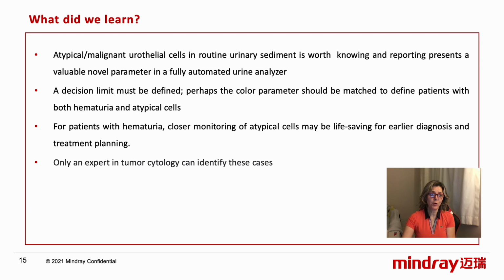What did we learn? This case has shown us that atypical malignant urothelial cells in routine urinary sediment are worth knowing and reporting, the presence being an available novel parameter in a fully automated urine analyzer.